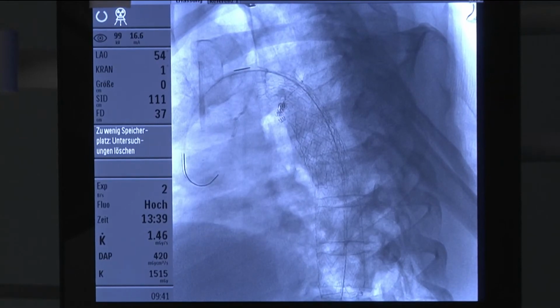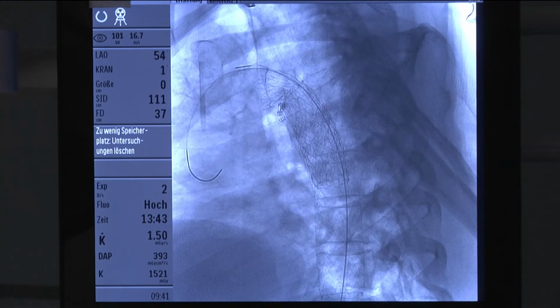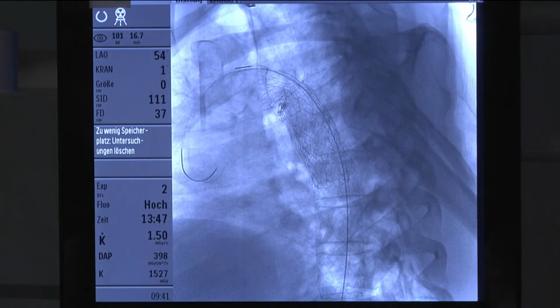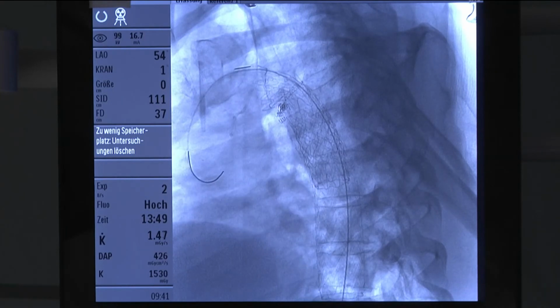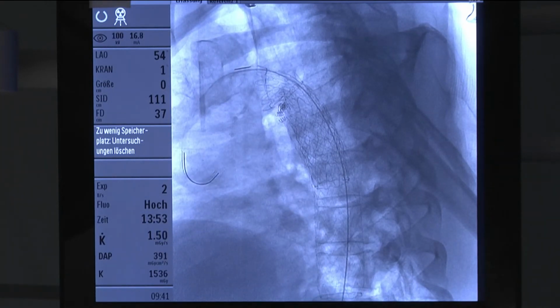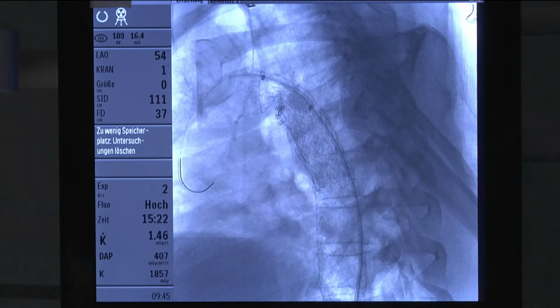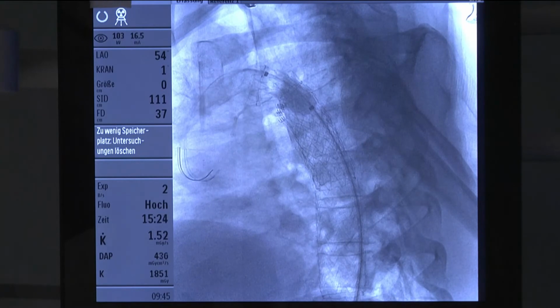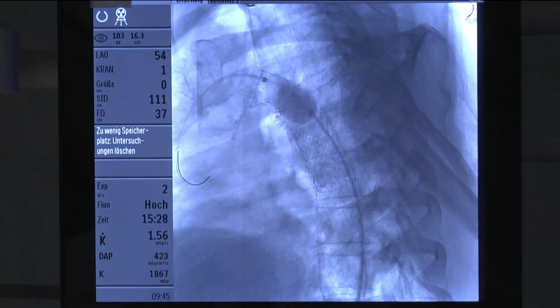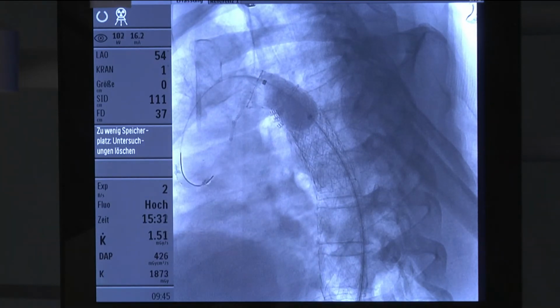We do not expect it to fully go off. We also see the stenosis. And now we're going to pull back our deployment system and try to dilate with a Coda balloon to solve this bird's beak problem. And we see that it is very nice. Hopefully we won't be having any recoil at this point.